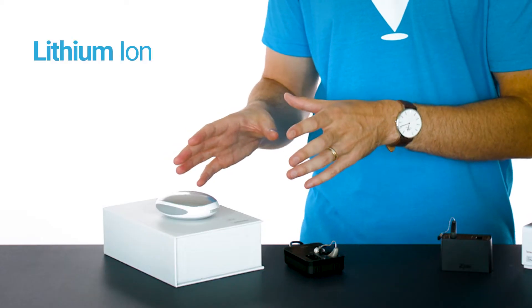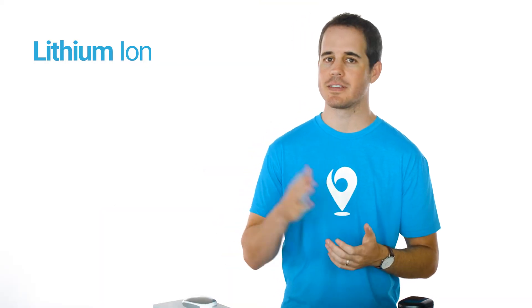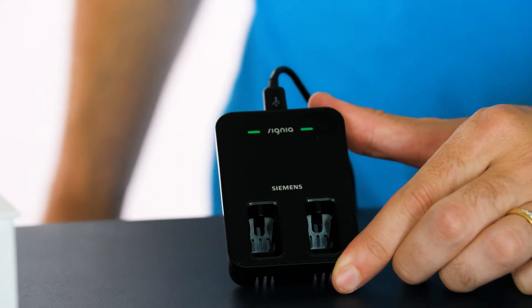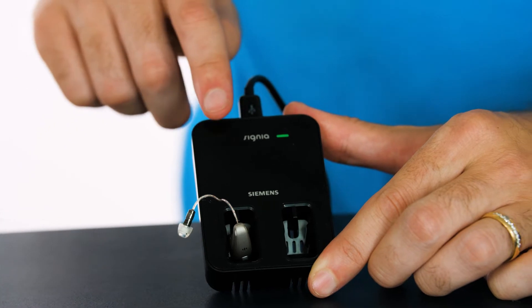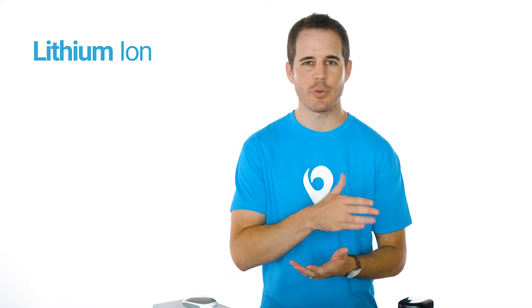Here we have a hearing aid powered by a lithium ion battery — the same kind of battery used in cell phones, electric toothbrushes, and some digital cameras. You probably have several devices powered by lithium ion batteries. Just like a silver zinc rechargeable battery, you put the aid in the charger when it's not in use. You'll get color indicators showing the charge status, and in around three to five hours the aid is fully charged up.